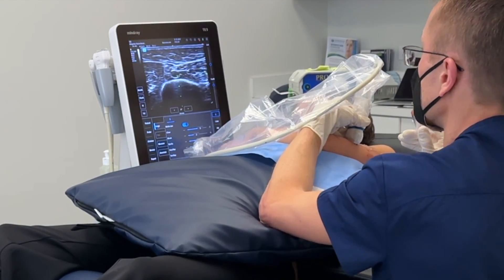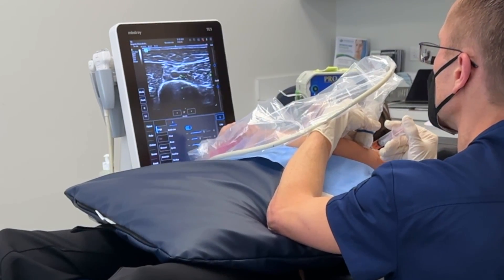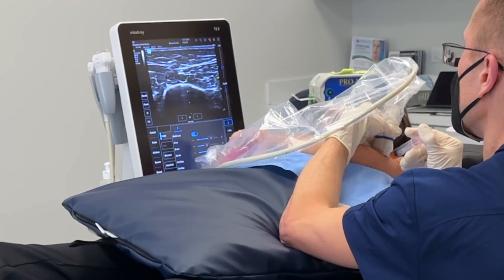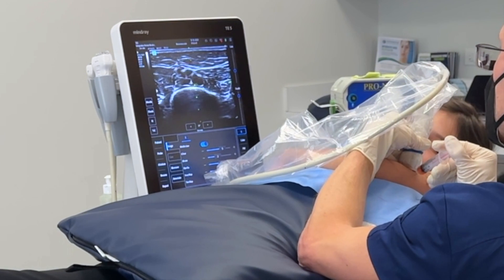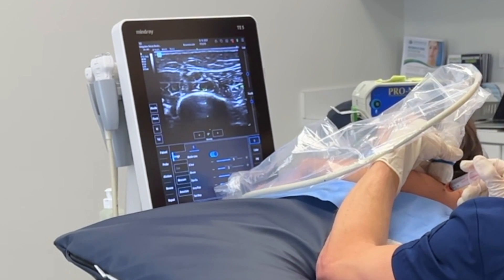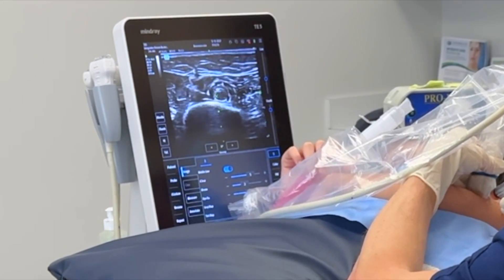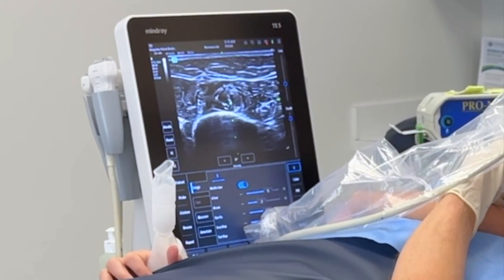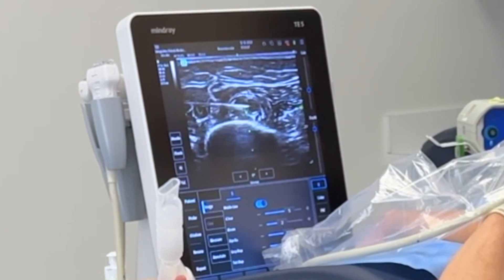Here's the radial nerve right in the middle of the screen by the X. You're going to see my needle coming in from the left. You can see it's big and swollen. And here's the PRP spreading underneath the nerve. I'm going to go above the nerve. And here you can see the PRP spreading above. And here it is underneath. I'm going to put a little tiny bit inside that nerve too.